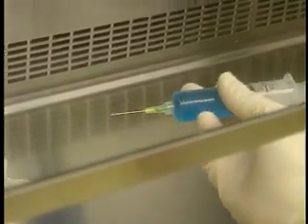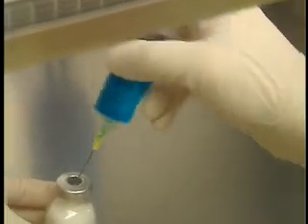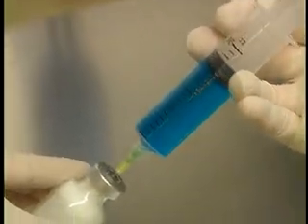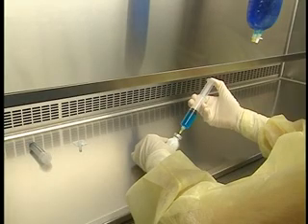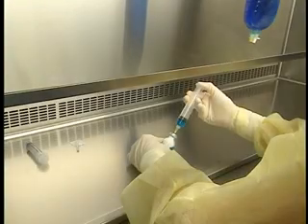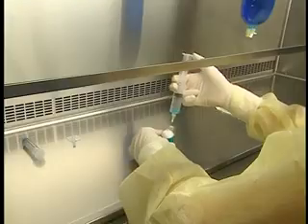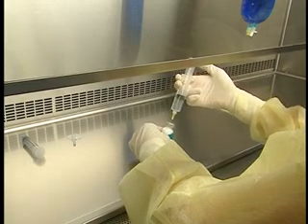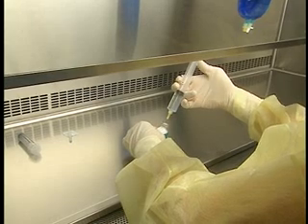Holding the syringe from underneath, insert the needle at a 45 degree angle into the circle in the center of the stopper, bevel side up. Rapidly bring the syringe to 90 degrees. Tilt the syringe-vial assembly to 30 degrees and slowly inject a small amount of fluid into the vial. Allow a little air to return into the syringe as soon as resistance is felt. Alternate between these two steps until all of the diluent has been injected. Equalize the pressure in the vial by drawing in a volume of air at least equivalent to the volume of fluid injected.